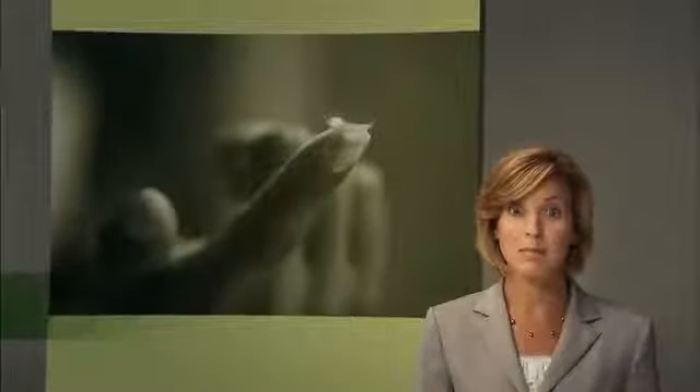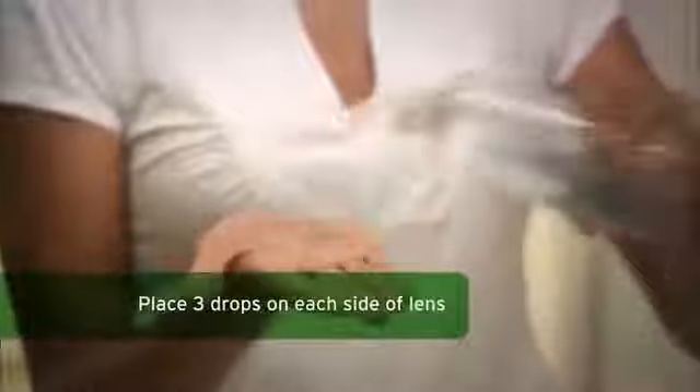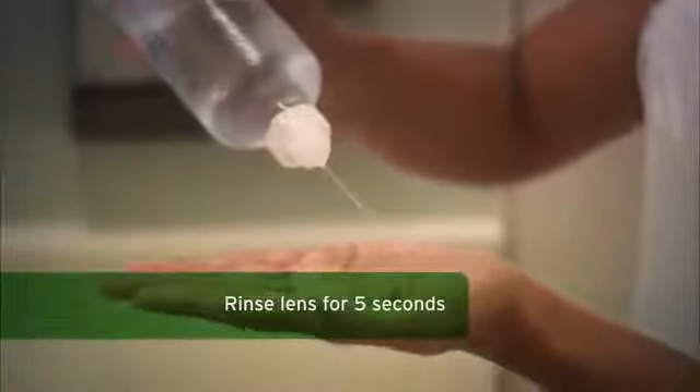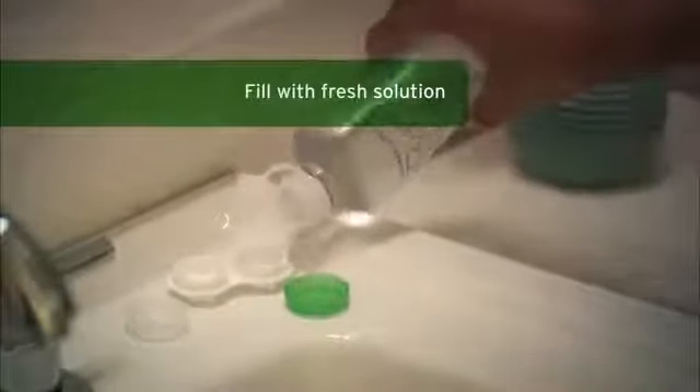Now that you've removed your lenses, you'll need to clean and disinfect them. Remember to do this after each use to keep your lenses comfortable and your eyes healthy. First, place at least three drops of BioTrue Multipurpose Solution on each side of the lens surface and gently rub in a back and forth motion for 20 seconds. Thoroughly rinse each side of the lens for five seconds with the solution. Place your clean contact lens in the lens case, fill with fresh BioTrue Multipurpose Solution, and soak for at least four hours. Always use fresh solution — never reuse or top off solution. Then just repeat these steps for your other eye.